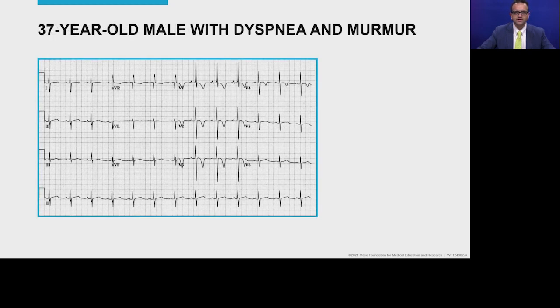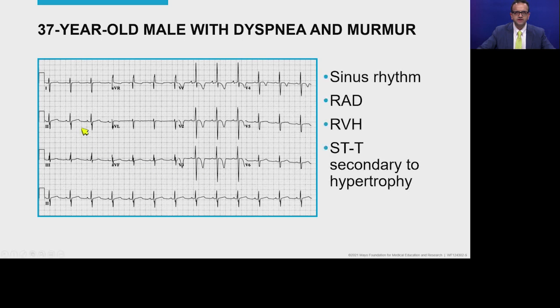We'll start off with an ECG of a 37-year-old male with dyspnea and a murmur. If you look at this ECG a little bit more carefully, the patient has sinus rhythm, right axis deviation, right ventricular hypertrophy, and some ST-T changes suggestive of hypertrophy — potentially right ventricular hypertrophy.